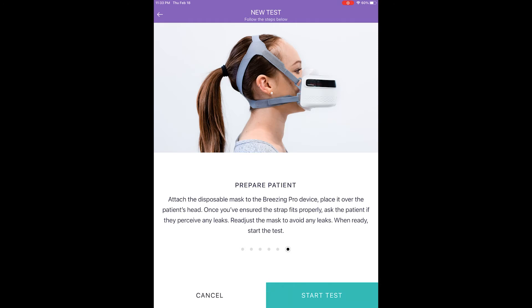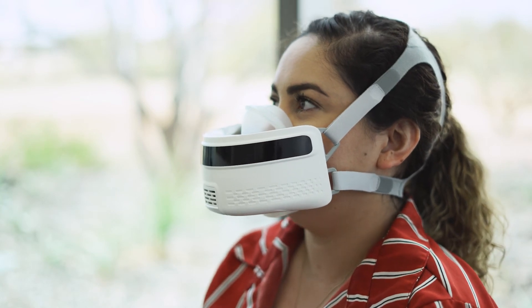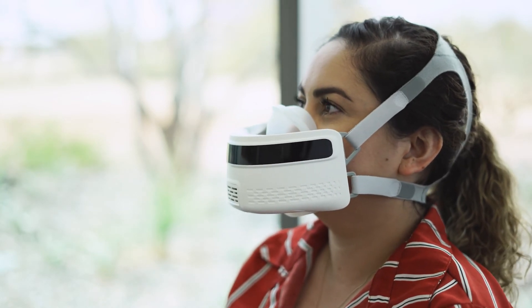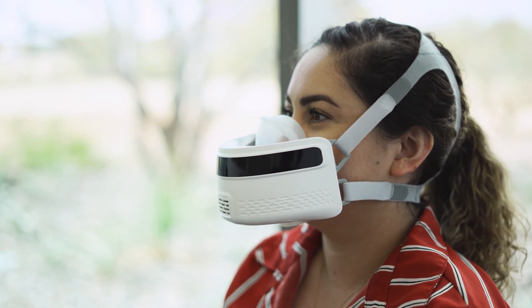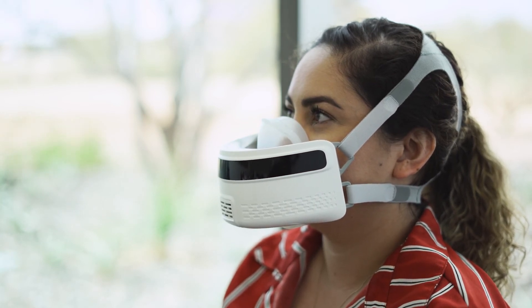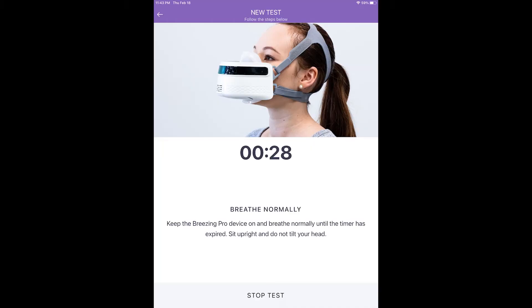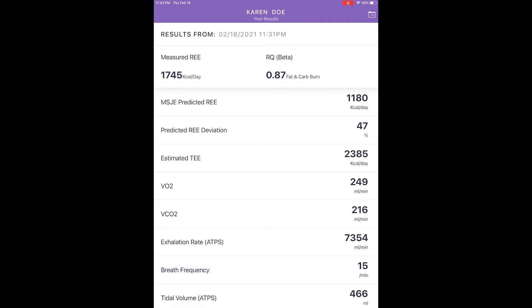Once you're satisfied with the mask fit, tap Start Test. Make sure the patient is relaxed and breathing comfortably. The patient should breathe with the nose, mouth, or both as normally breathes. Some minor movement during the test is okay, but the patient should remain comfortably seated for the duration. After pressing Start, the countdown indicates the time remaining in the test. Once the countdown is complete, the app will automatically progress to the next step and display the results. The app will automatically move to the results screen once the 10-minute test countdown is complete.